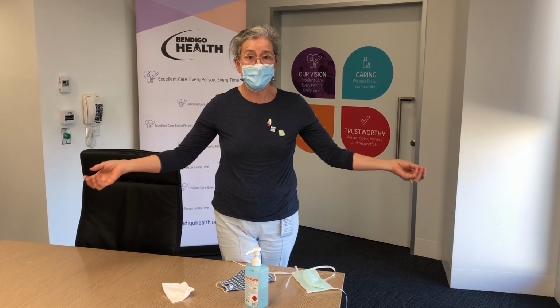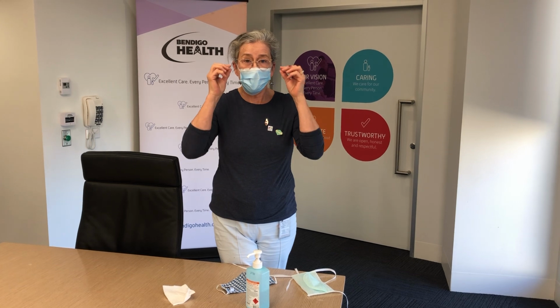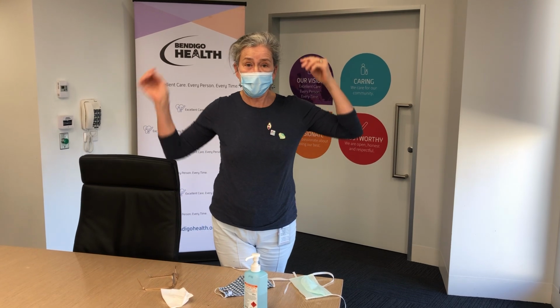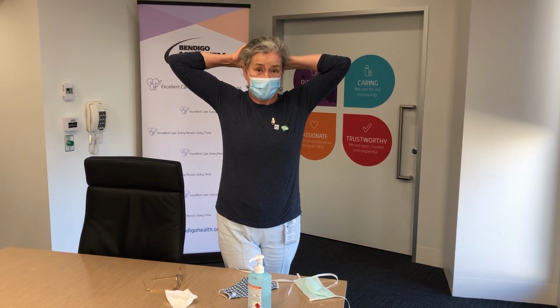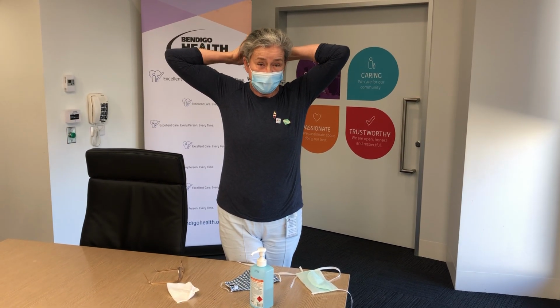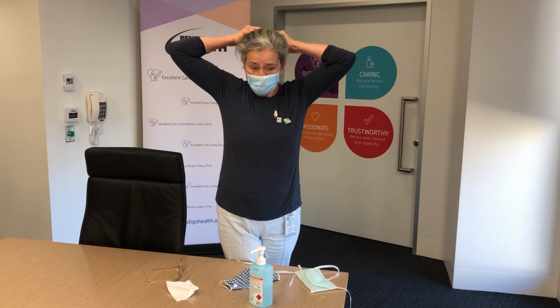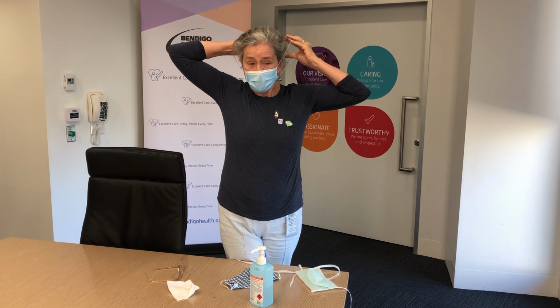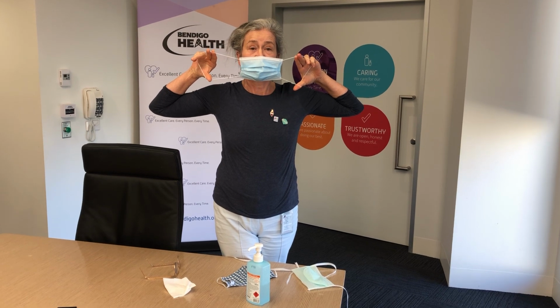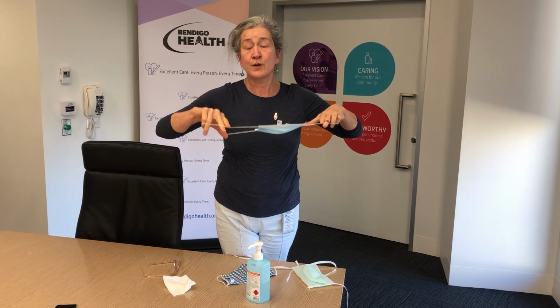Then really the on-off of these masks is where you want to minimise that. So try not to touch the mask, try and keep your hands away from the mask, but if you do need to take it off, what you've then got to do is try and imagine that everything that's blue is potentially infected and infectious, and you want to minimise that movement away from your face and your breathing apparatus, your mouth and your nose. So when you take the thing off, really you want to take it off without too much movement and move it away and down from your face.